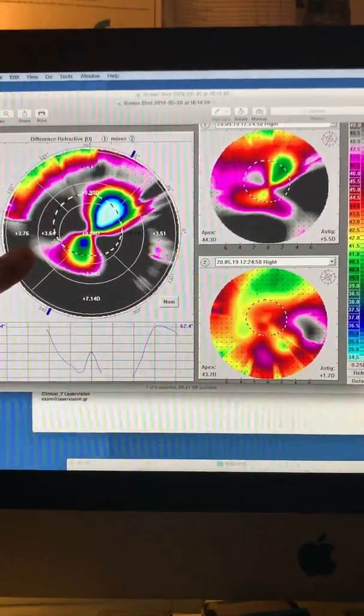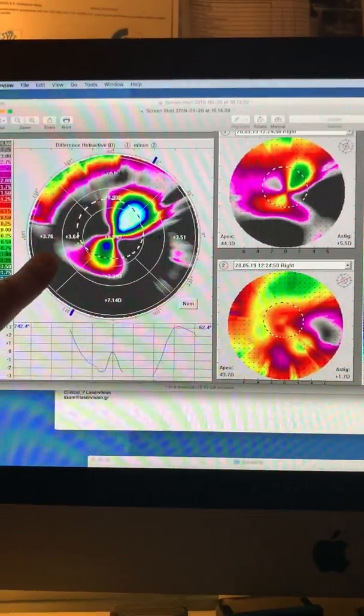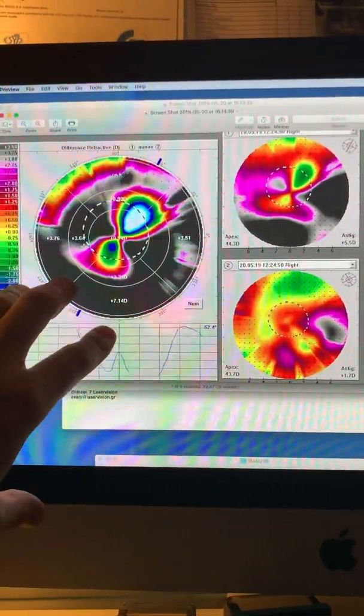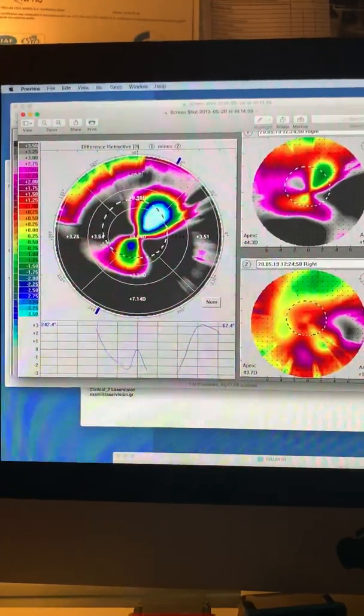showing how accurate the WaveLight EX500 laser was able, with these very images, to normalize the cornea.